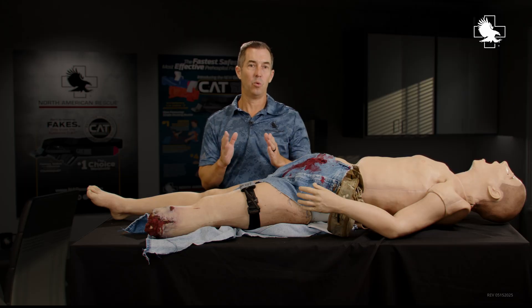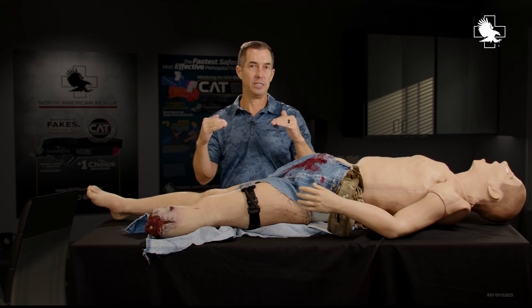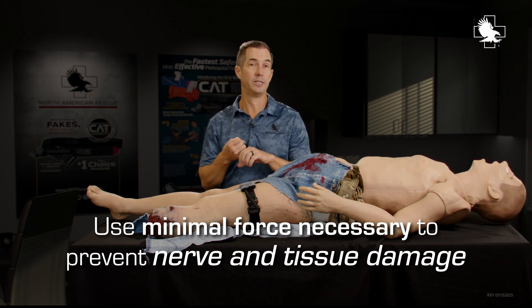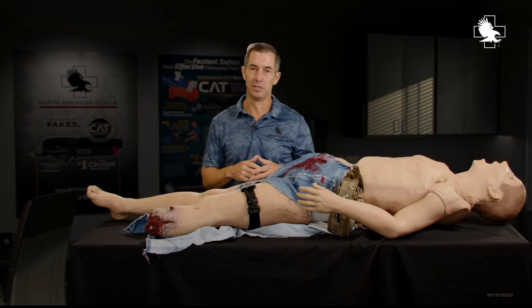If you have a wide tourniquet, it creates a wider pressure wave that gets deeper with less amount of force. We want to use the minimal force necessary so we don't damage tissue or nerves, but we're still being effective and stopping arterial flow. It's the same reason why in the operating room, they use large wide tourniquets to stop blood flow during orthopedic surgery of the extremities.